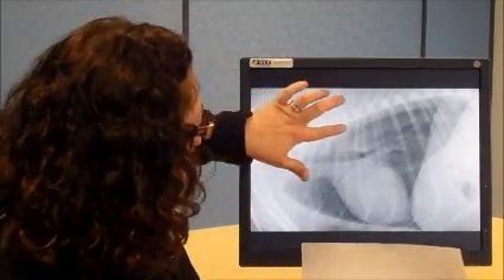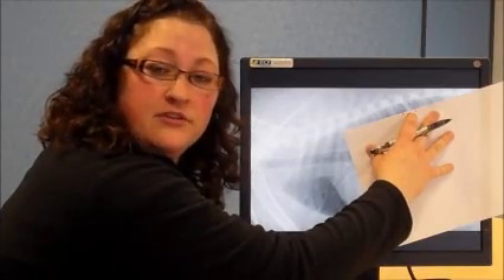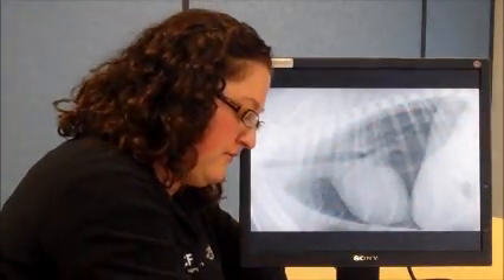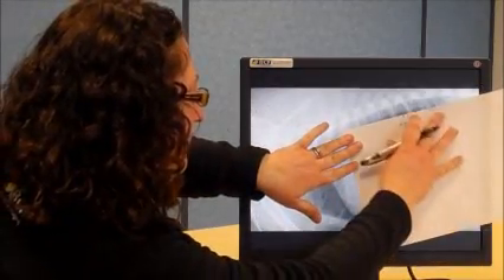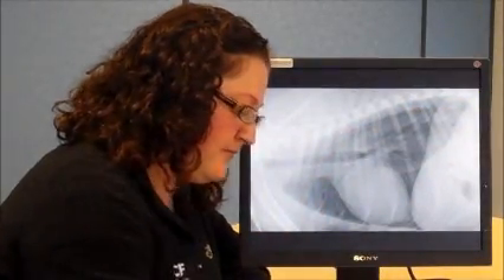You always start from the cranial end plate. You will measure the length of the line in vertebral body spaces, measured up to one decimal point — for example, 4.3 for the first measurement, and 5.2 for the second. You then add these values together, and this numerical value is your vertebral heart score — in this case, 9.5.